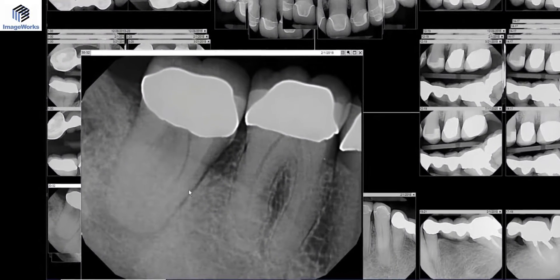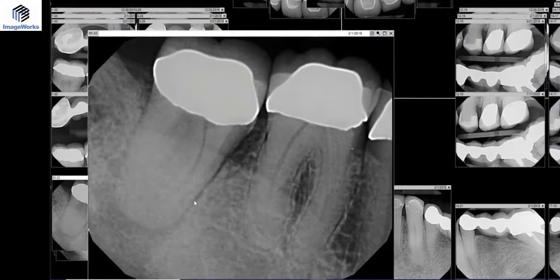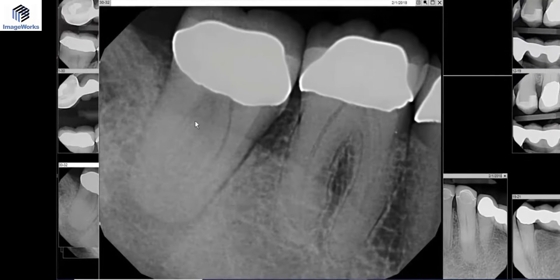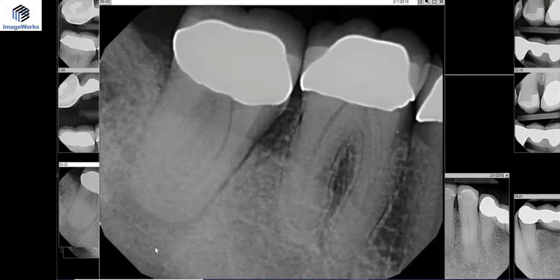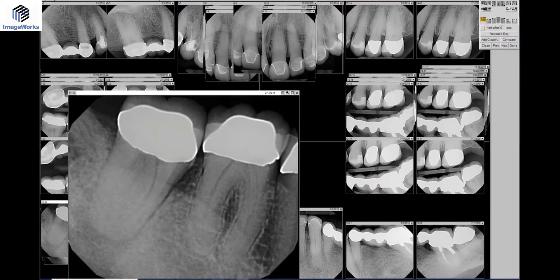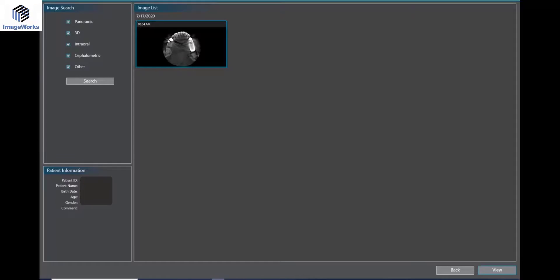This patient presented with tooth 18, lower left second molar, with changes in the bone. The main finding was a buccal fistula — a buccal tract draining out. You can see some change here, so I wanted to run the cone beam on it, and this is what we saw.